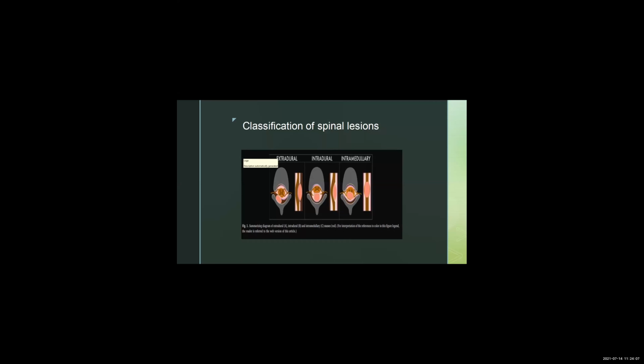That's a good question. I'll talk about CT and MRI. CT has advantages that MRI does not. The big disadvantage with MRI is that you don't see the bones that well. With CT, you can pick up a fracture much more easily than on an MRI. So that's one reason.